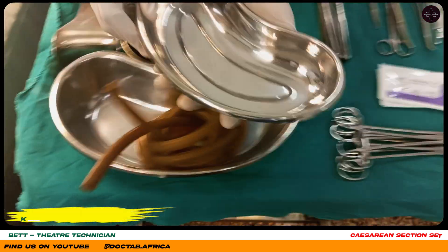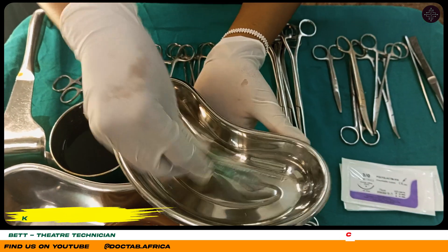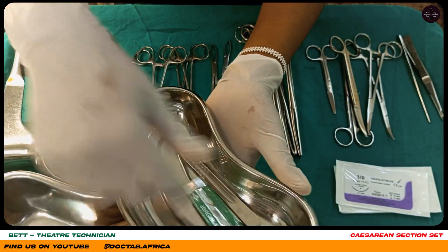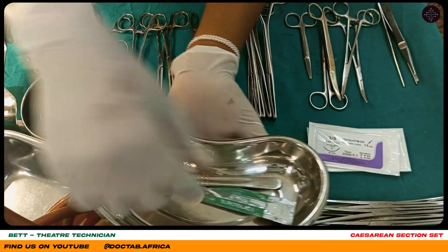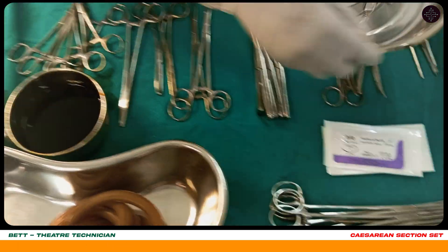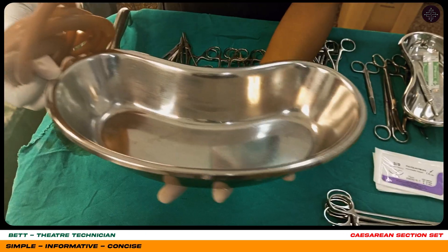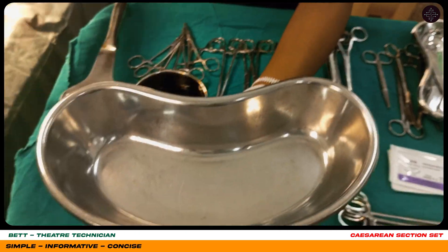This is our kidney dish. This is where we hold our sharps. After we have mounted our blade, we hold it with this. And even our sutures — we use this kidney dish. The big kidney dish is used for holding the placenta after the surgery.